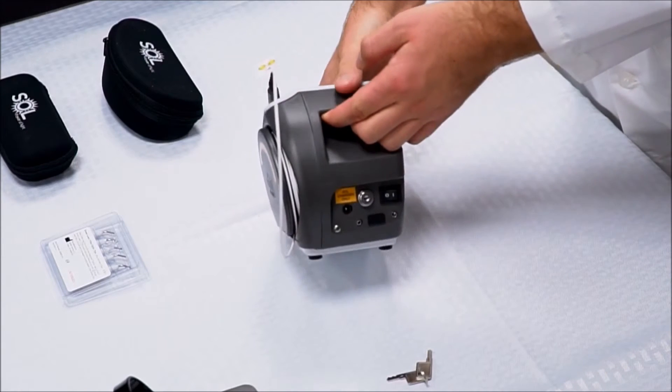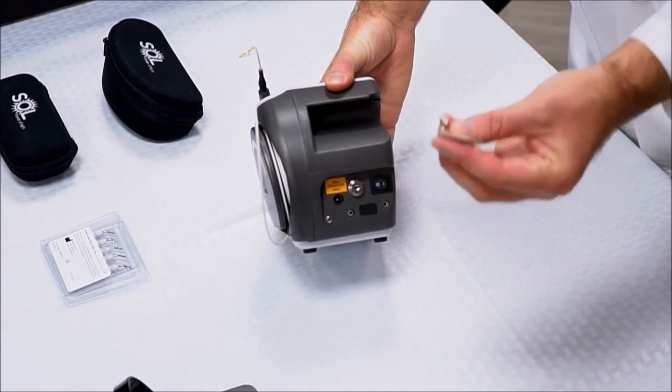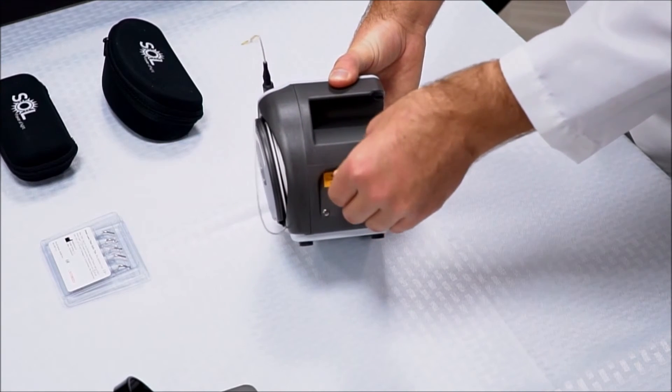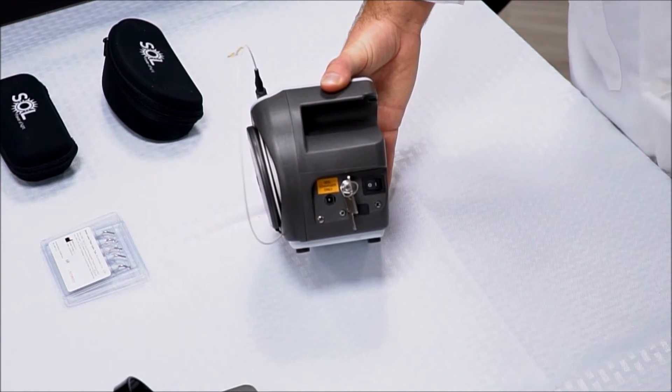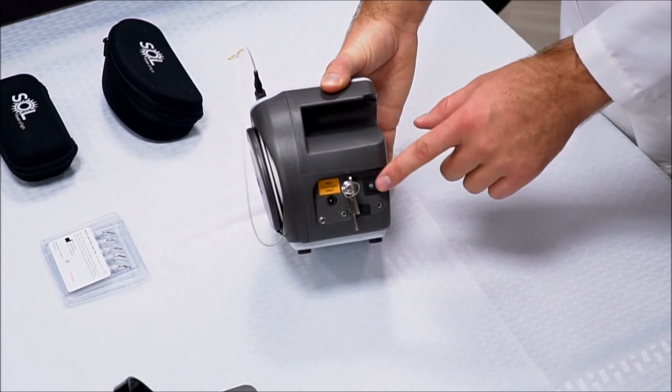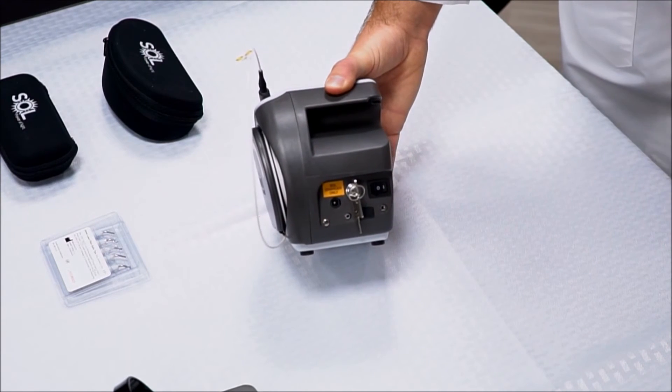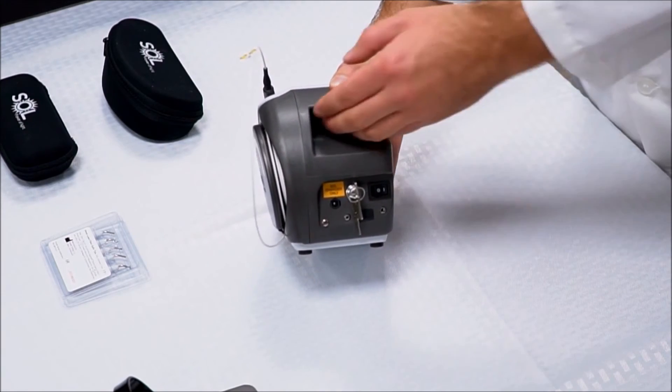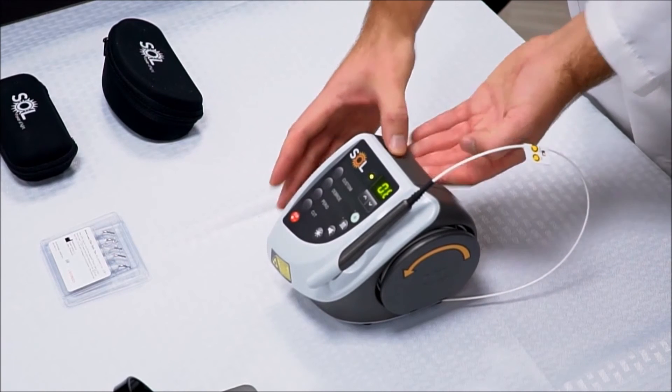To turn it on, look in the back of the unit, take the supplied keys, place them into the key slot here, and twist them on. That unlocks the laser unit. Now, for additional safety, turn on the power button. You should hear an activation beep, and now your laser unit is ready to be used.